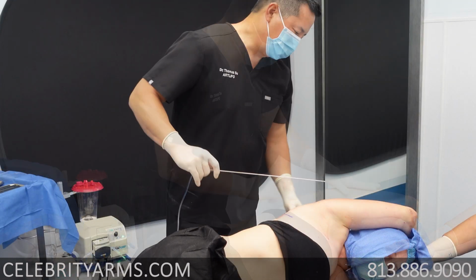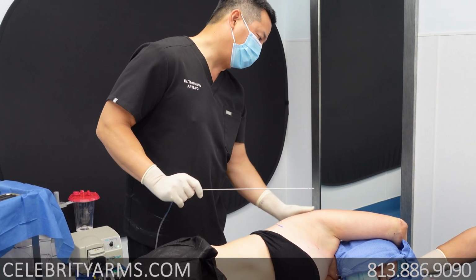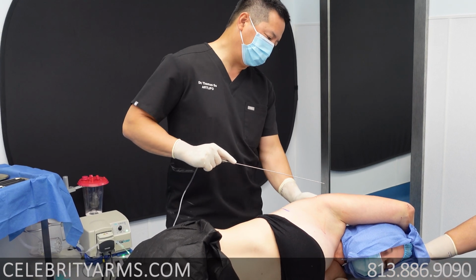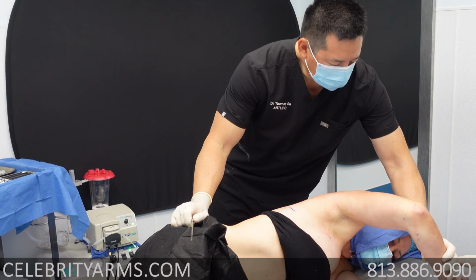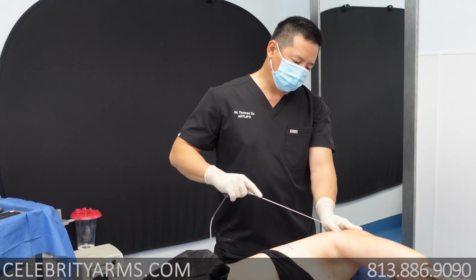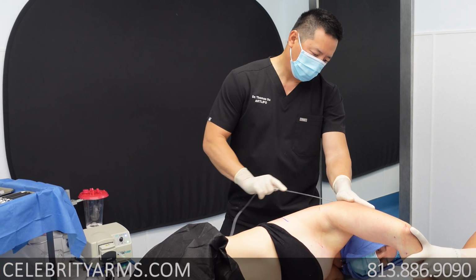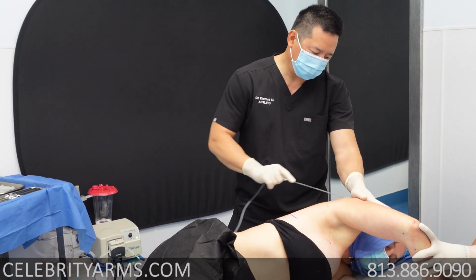No. So I told Lisa this is like our boot camp. It's a boot camp from the sense that patients are required to hold their bodies tight in these different positions the whole time. Let's put you in the bridge here. Hold that right there. So she's held firm so that I don't lose control of things, and I can keep that sculpting process as smooth as possible.